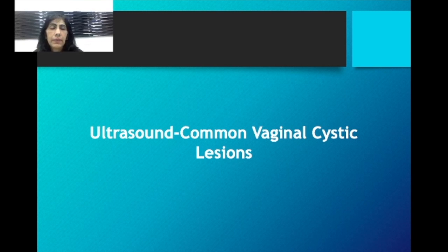Sometimes, since the positions are very close to each other, we get confused about what it could be, and it is important that we differentiate. All of them are cystic lesions, all of them can get infected, all of them look very similar, but the management may be different for each one of them. So it is important for us to create a differential diagnosis as far as possible on ultrasound.